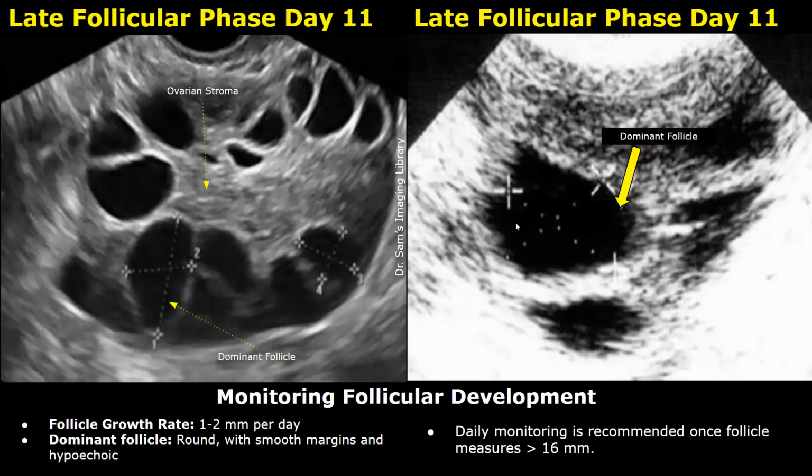The number of follicles present in the ovary depends on the patient's age. In younger patients, more follicles are seen in the ovary as compared to older ones.